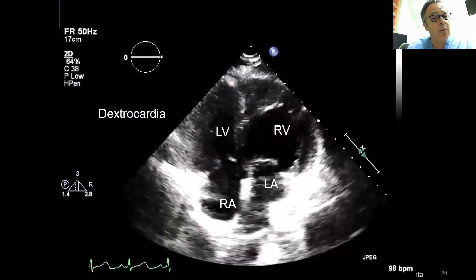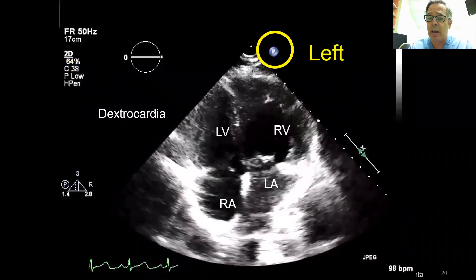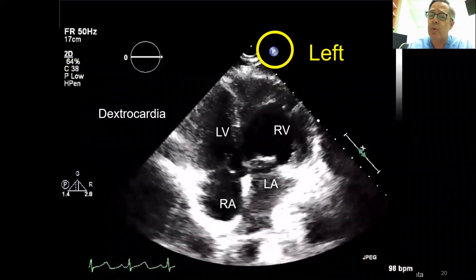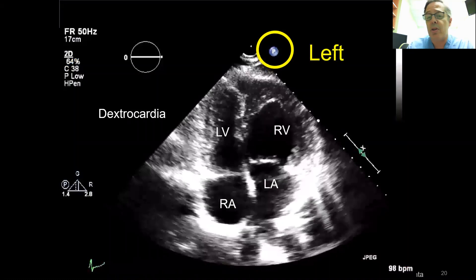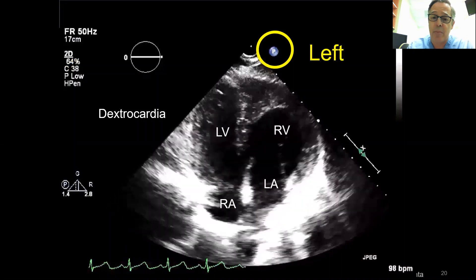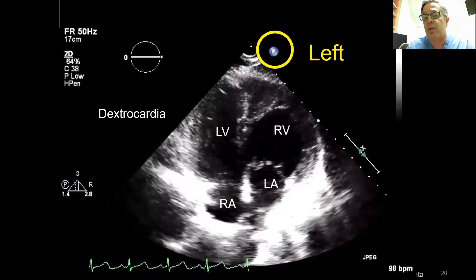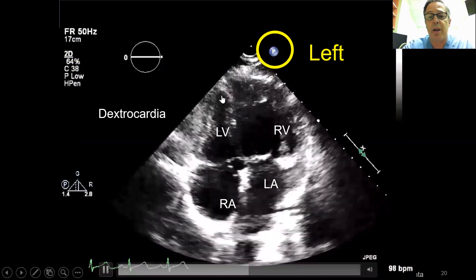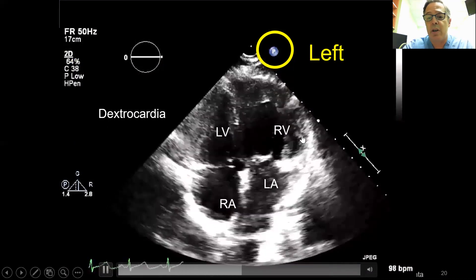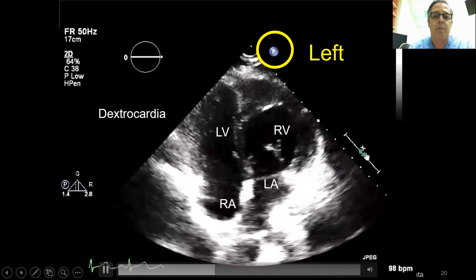In this case example, the patient has dextrocardia and we see the LA connected to the RV. The marker is oriented to the left and the probe is on the right apical position. We have the LA connected to a morphologic RV — you can clearly see the moderator band — so this is inverted ventricular arrangement with an L-looped arrangement.